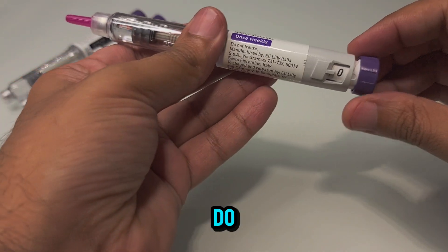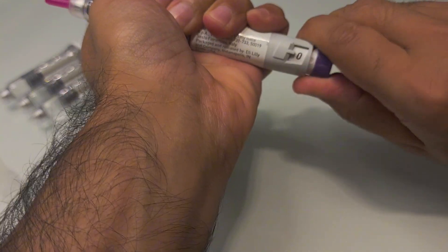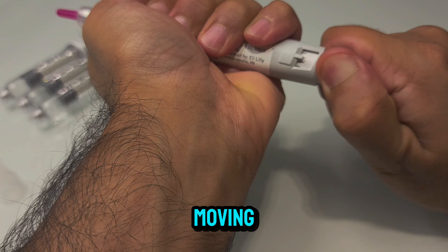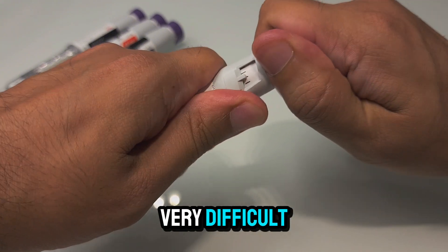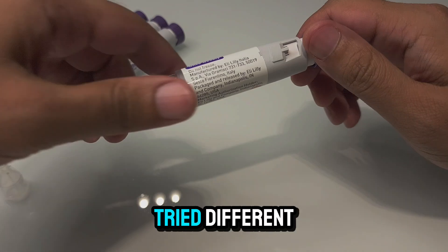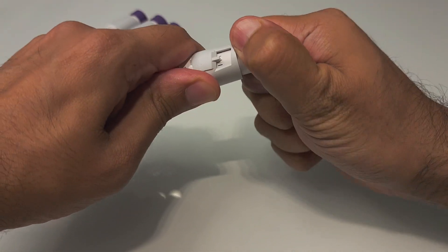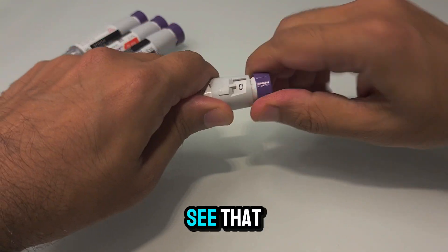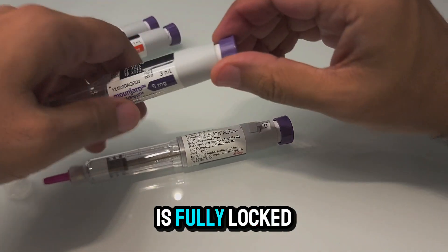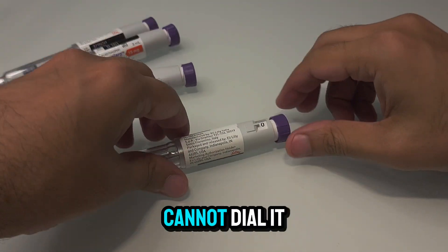The first thing I'll try to do is to dial it back with some force. I can see this is very tight — it is not moving at all. It's very difficult to move it further. Some people have tried different instruments to force it further. I can clearly see that the device is fully locked, and the same applies to this one — you cannot dial it further.